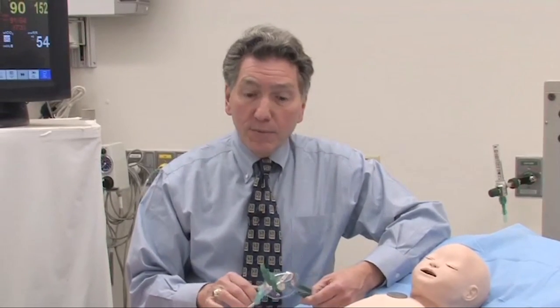Hi. My name is Bob Pascucci. I'm one of the ICU staff here at Children's Hospital Boston. I wanted to spend a little time today with you going over ways to deliver oxygen to a child who is in respiratory distress. I'll be using fairly standard pieces of equipment. They may or may not be immediately available to you in your practice, but there are probably things very similar that would be available locally for you to use.